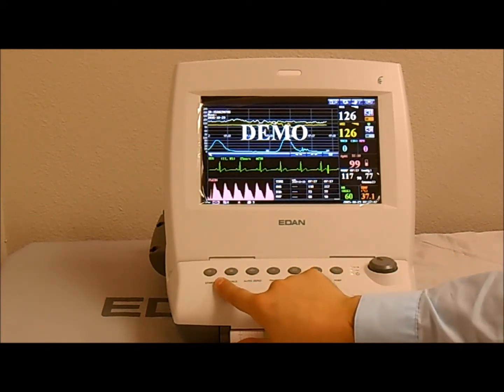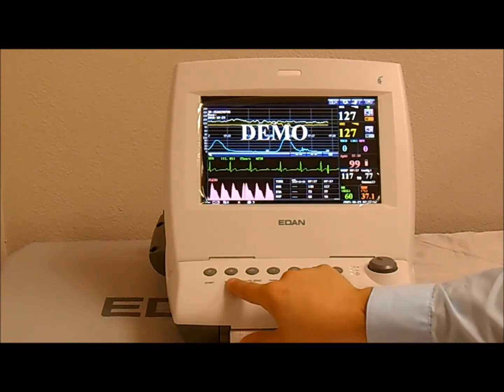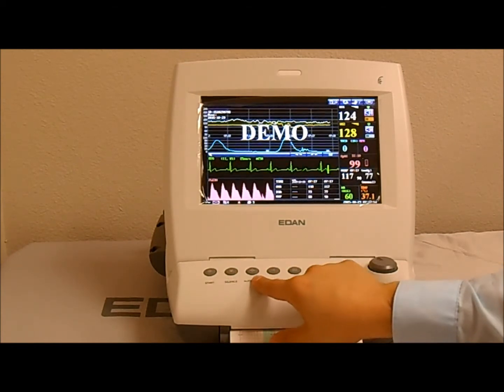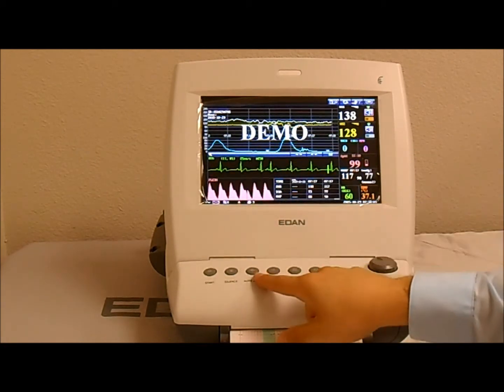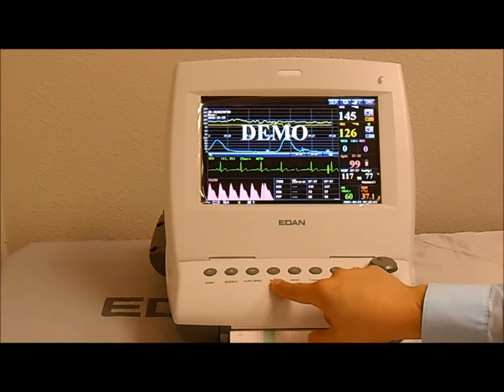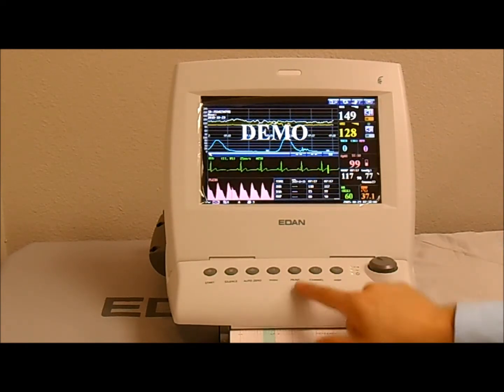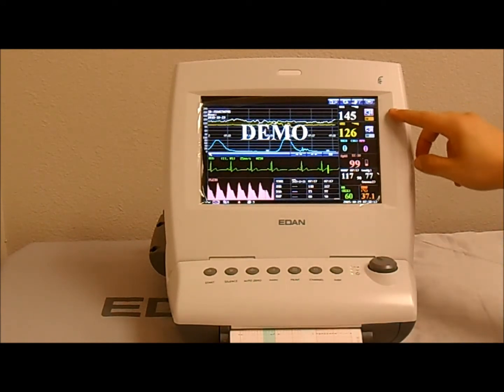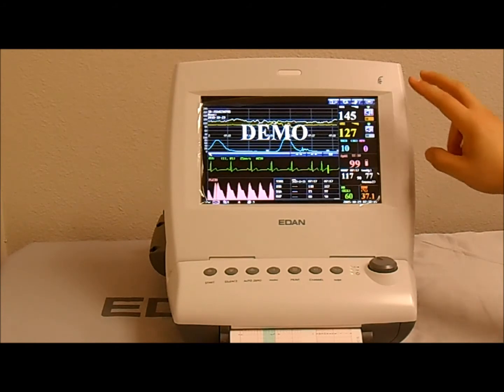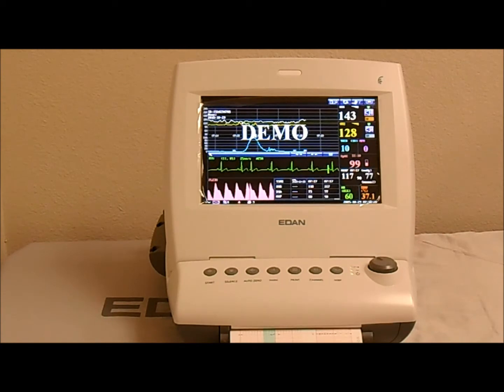keypad. Start, to start a new monitoring session for a new patient. Silence, to silence the alarm. Auto zero, in case the toco transducer fell off, you put it back on the patient and press the auto zero to take it back to baseline. Mark, to put a marker of an event on the CTG waveform. Print, to stop or start printing. Channel, to go from the audio feedback of FHR1 to FHR2 and vice versa. And NIBP, press it to take the NIBP reading of your patient.